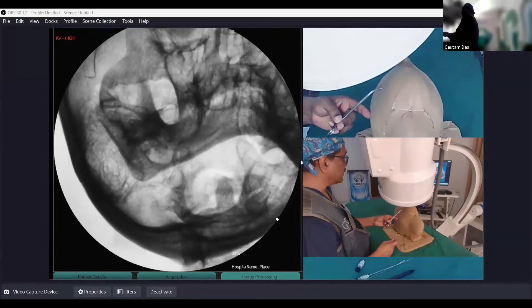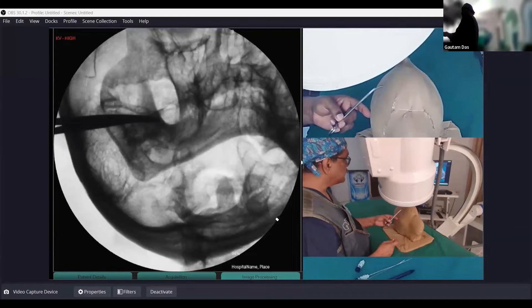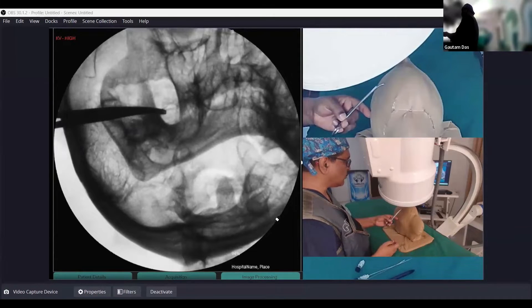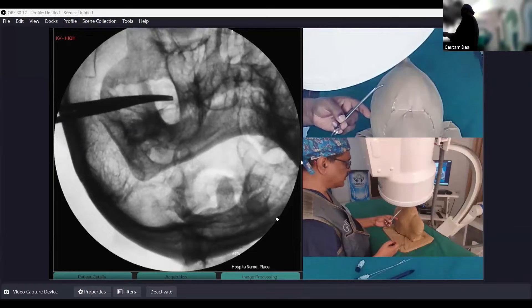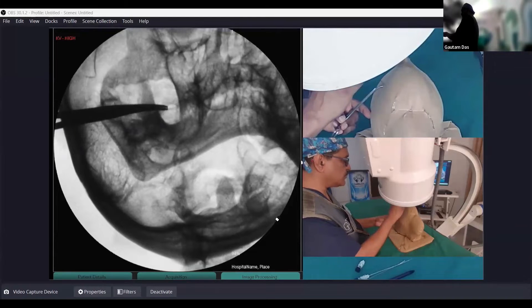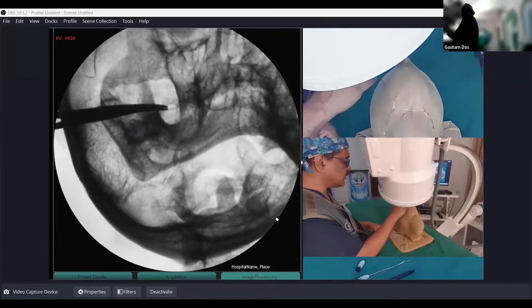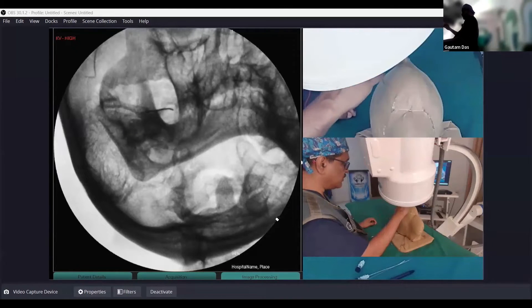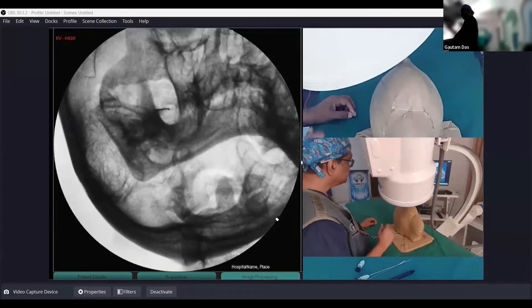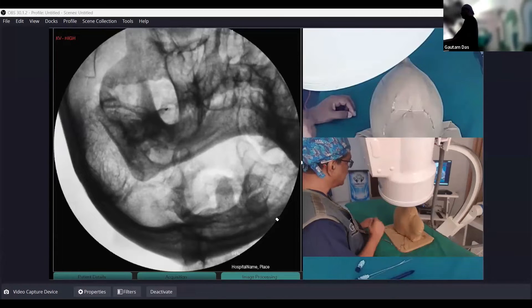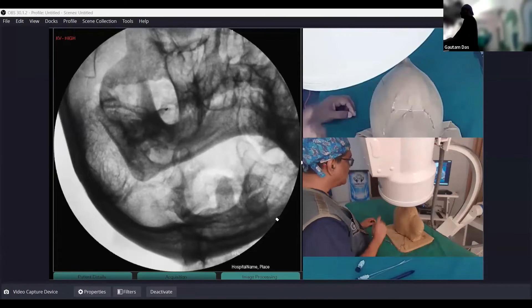I will be putting a radiopaque marker here. There is no need to measure three centimeters or any other distance — all those measurements are for the blind procedure. When going with tunnel vision, you need not measure anything. Just identify the foramen ovale and go by tunnel vision, advancing the needle inside the foramen ovale.